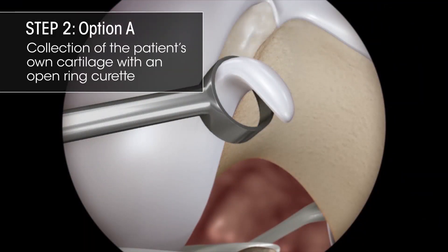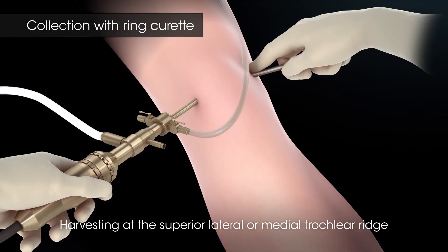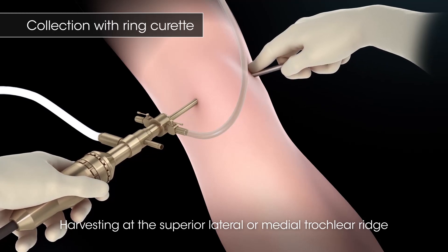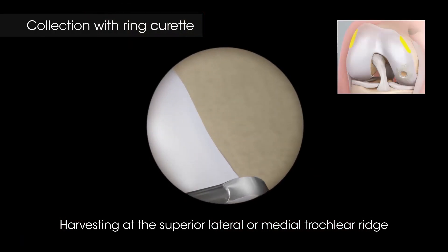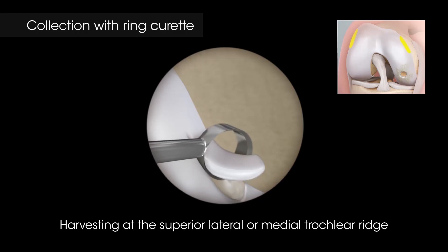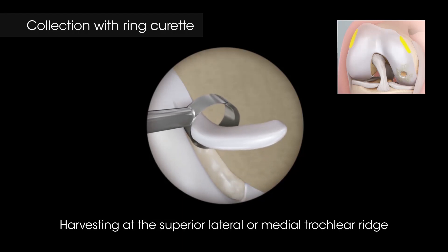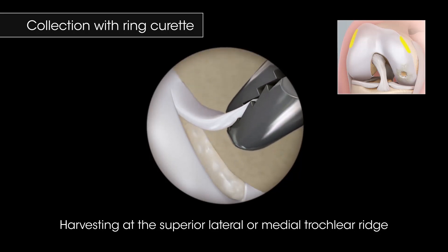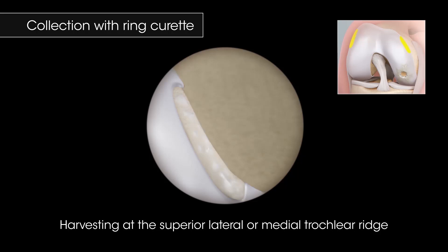Collection of the Patient's Own Cartilage with an Open Ring Curette. When harvesting at the superior lateral or medial trochlear ridge with a ring curette, create a crescent-shaped specimen by engaging the back of the curette. Loosen the specimen by moving the curette in a side-to-side motion. Leave the distal end attached and remove the tissue with an arthroscopic grasper.